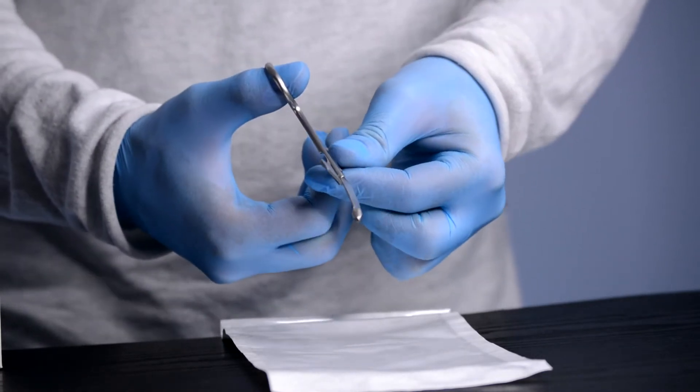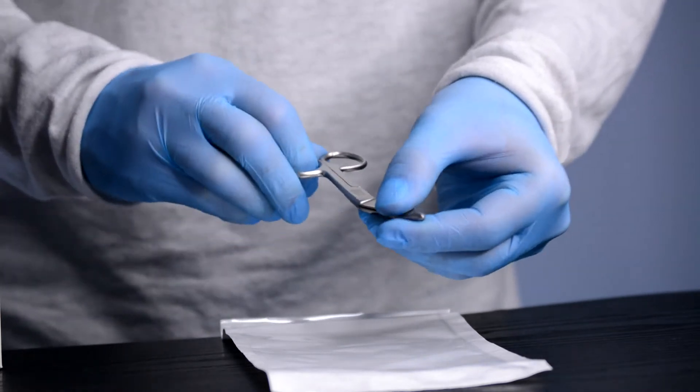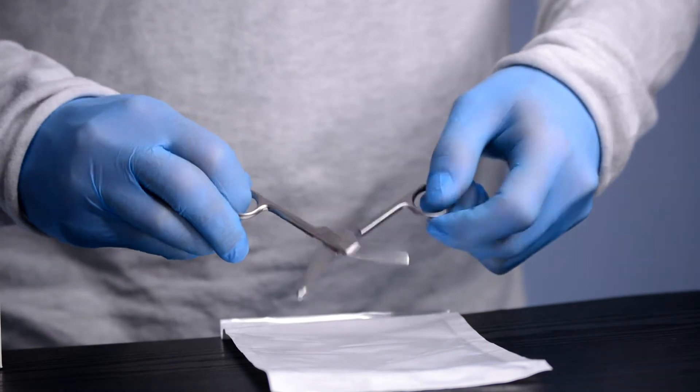They are made from a high-grade medical steel ensuring durability. Each scissor is subject to our strict quality control procedures.